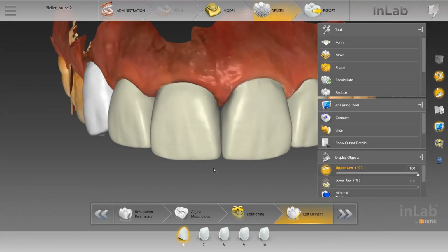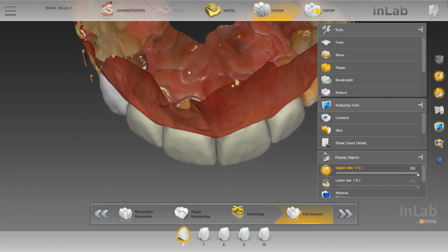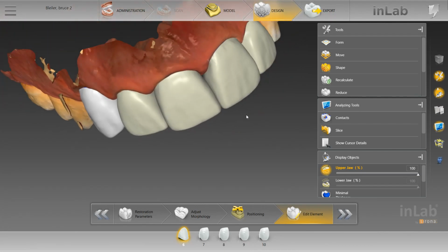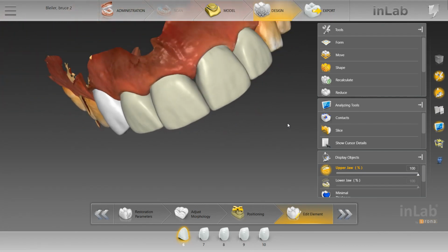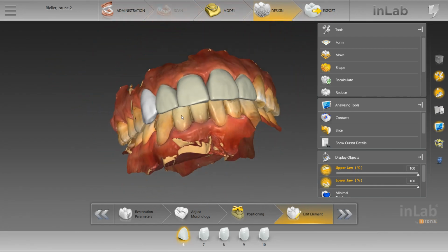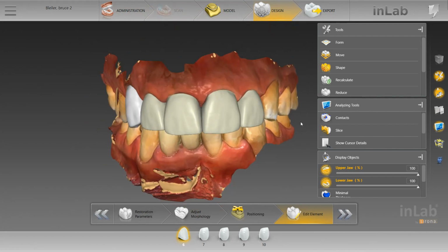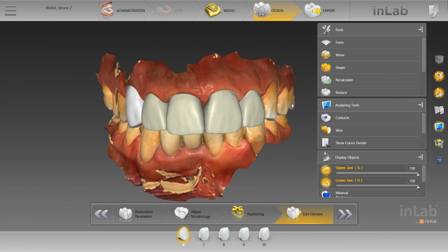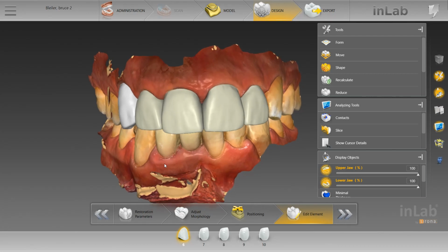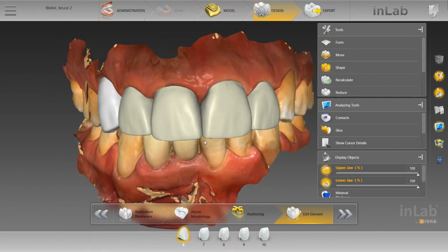Everyone, I recently received a question asking about how to get a good midline. Some of you may be having difficulties getting a smooth, straight midline, something that is in line with the lower jaw. So this is the workflow that I use, and pictures definitely aid in getting a predictable midline. However, just for the sake of this video, we don't have pictures, but I will show you a technique that I use to get it just right.